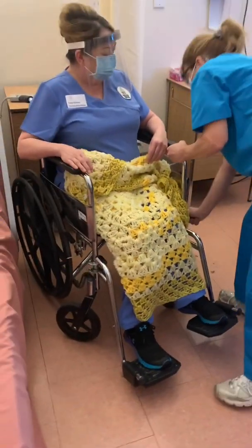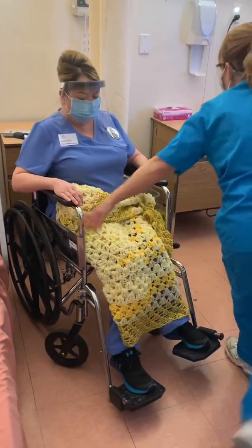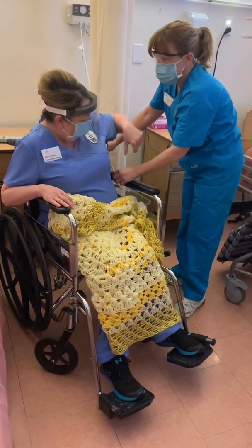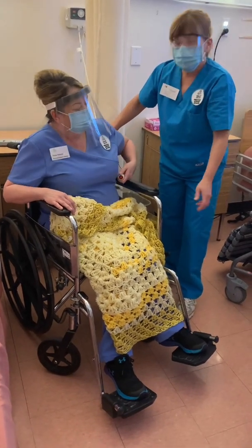Right. Okay, so I'm going to make sure that the wheels are locked. And I'm going to make sure you have your call bell accessible in case you need anything. I'm just going to pretend it's close enough. The call bell's close enough. Thank you, dear.